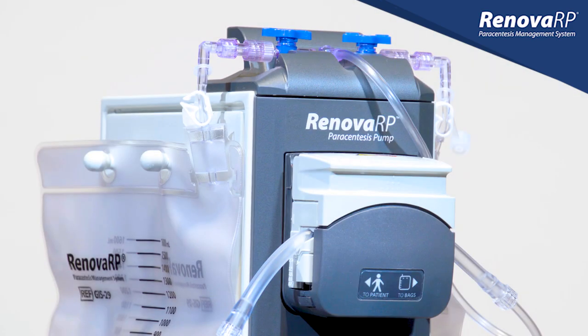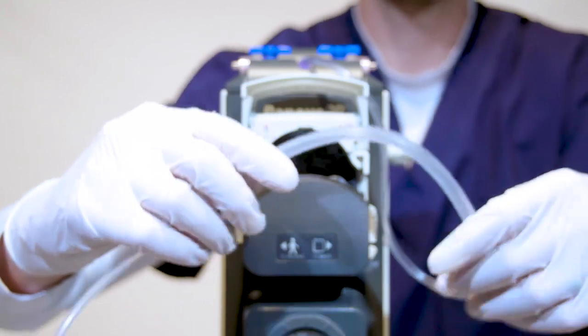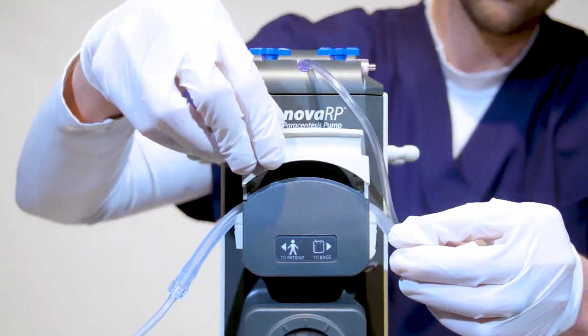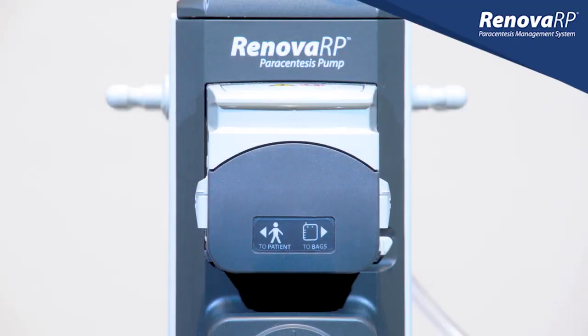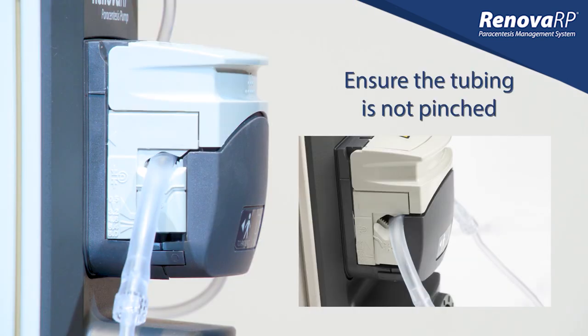If you experience a situation where the pump is running but fluid is not moving, confirm that the larger diameter tubing section is positioned properly over the pump rollers with the flip top closed. Be sure the direction of the tubing matches the visual indicator on the front of the pump head. When the flip top is closed, ensure that the tubing is centered in the track and is not pinched.